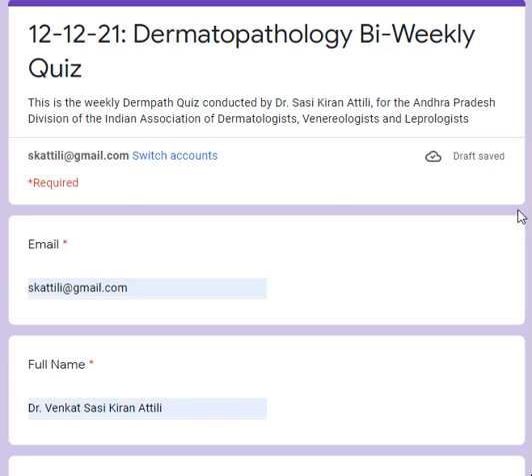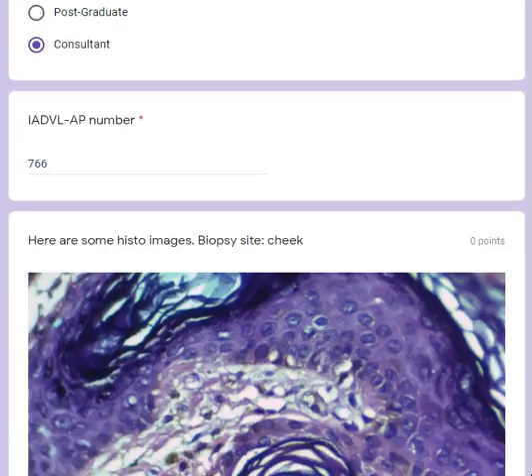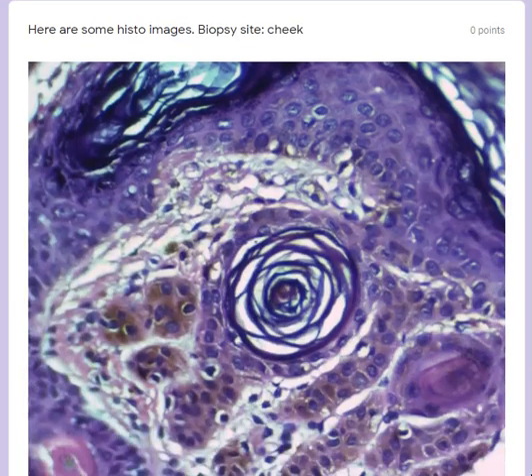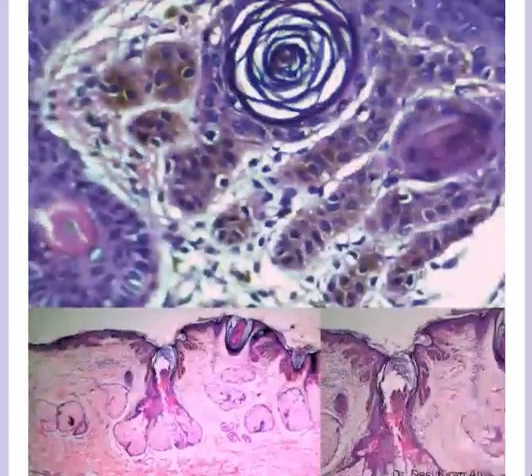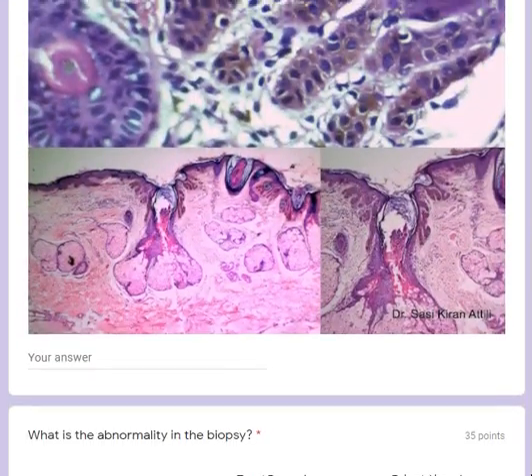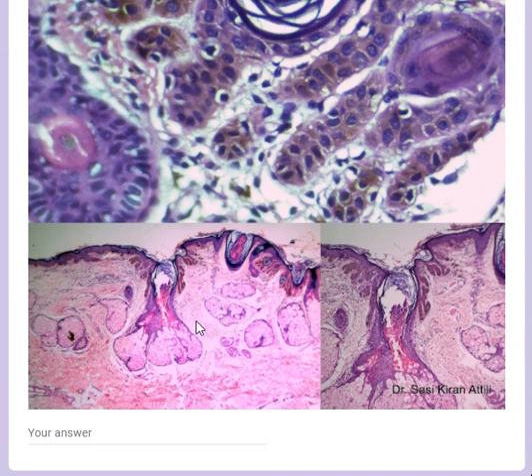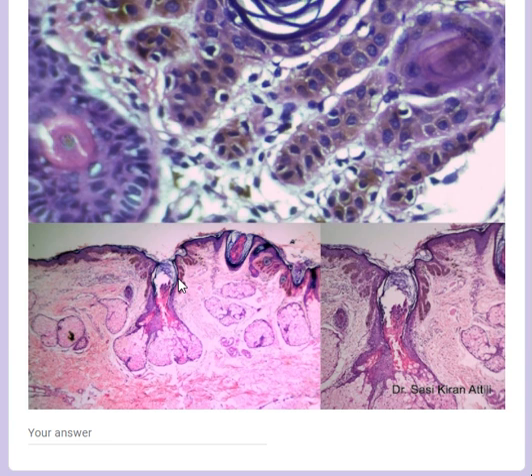Hello everybody, this is the histopathology quiz this week. Looking at the low power view, you can make out that this is a biopsy probably from the face, because you're seeing a lot of pilosebaceous units here. What is prominent is these sort of brown structures coming down from the epidermis.